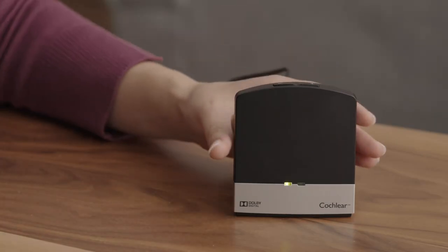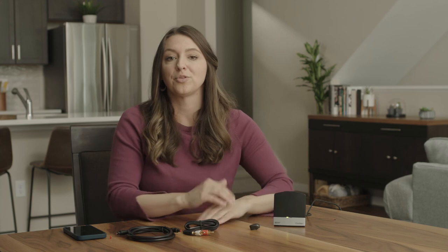You can adjust the volume on either the TV streamer or through the Baja Smart App. That's it — now you can enjoy your TV hearing experience.